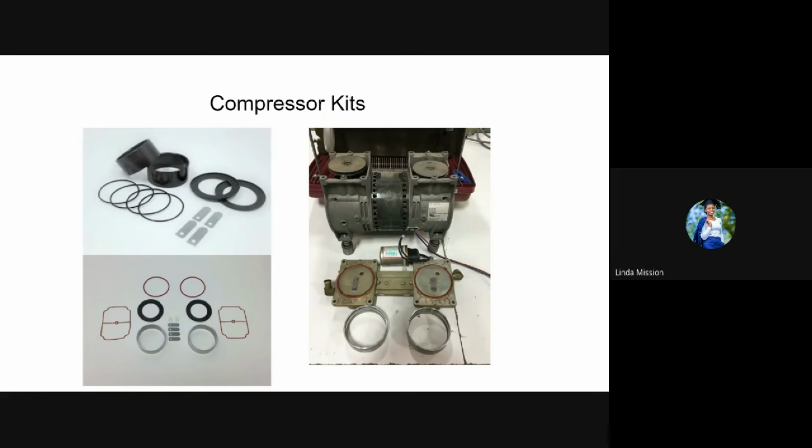Therefore, it is important to check the status of the compressor and service it when the concentrator has run for a certain period of time. If you haven't changed anything and the noise in the concentrator has changed, the service kits may be worn out.